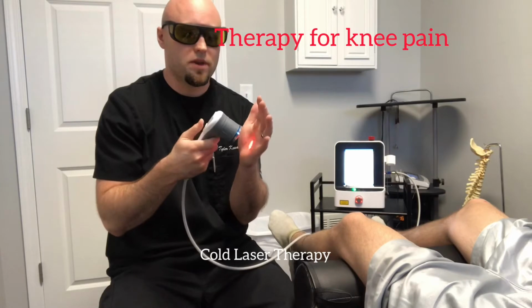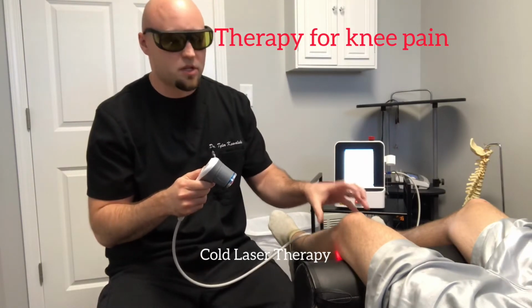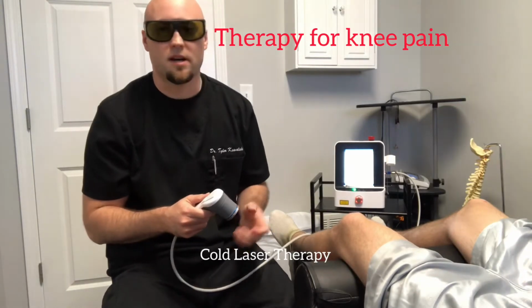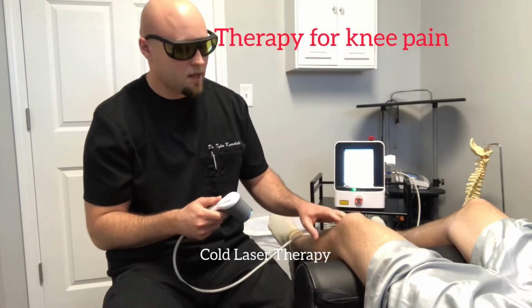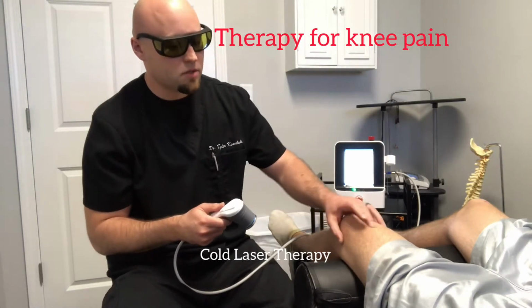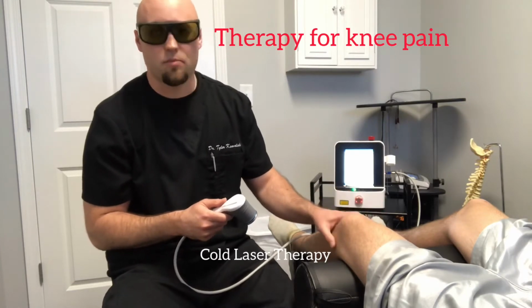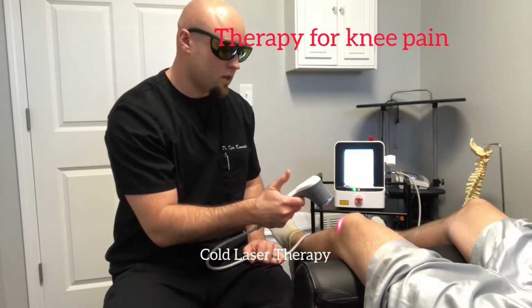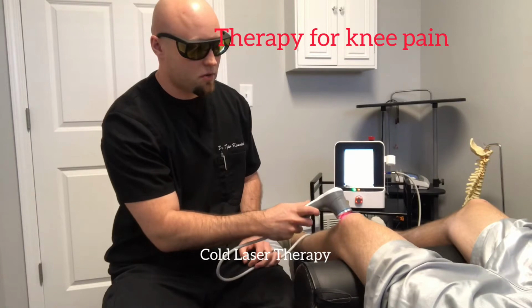And so the way this works is it shines this laser light through any injured or damaged tissue, helps with pain, inflammation, also helps with just increasing the healing time. So if you have a sprained ligament, sprained muscle, any muscle, soft tissue stuff, it's just going to help that get rid of the inflammation and help with the overall pain. So I'll show you an example of this. When we turn it on, you'll hear that beep in the background. That means the laser is actually going.